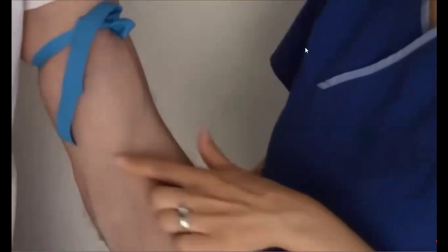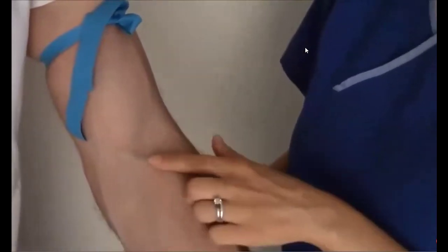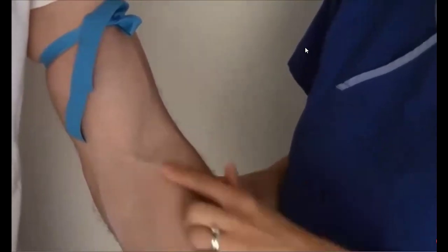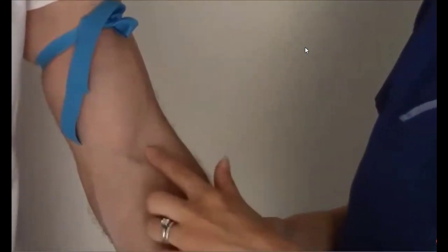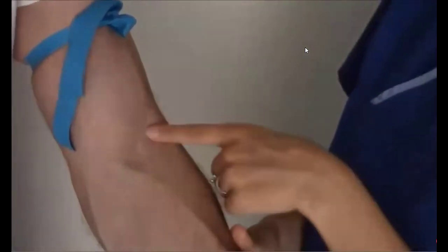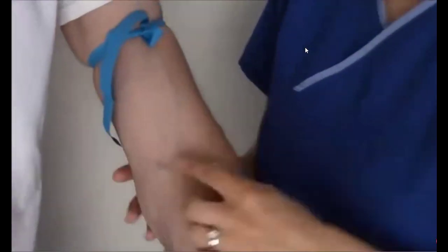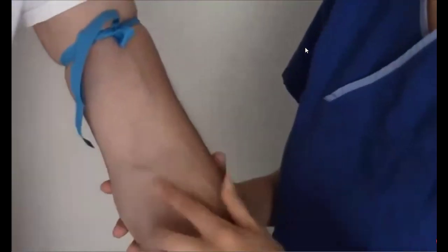Right here is a vein. This is a very large, great vein. You could get an 18 gauge in this vein. There's a vein right here in the middle. I really like this vein. I normally use it a lot because it's in patients that I can easily find. I don't see this vein a lot, especially in females. I normally see this vein, so I stick that one. And then this one. This is another favorite one. People really like to draw blood out of this one too.